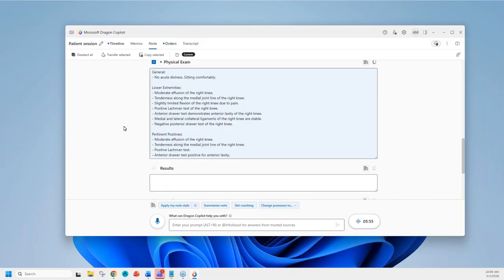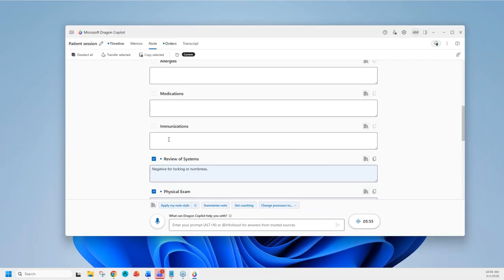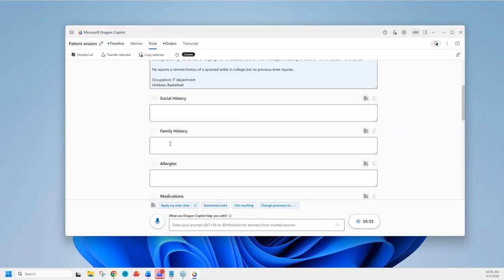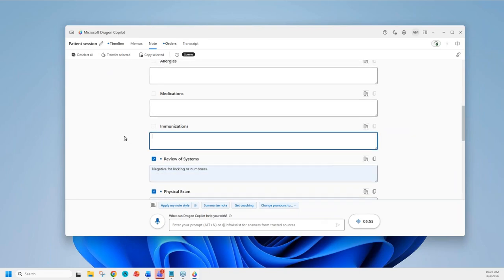Okay, so let's add some dictation. So let's see, I didn't do any procedures on you, Mark, so I think you're safe there. How's your vaccine schedule these days? You fully up to date? I am. Let's go ahead and document that. Patient's vaccination schedule is fully up to date, period. Scratch that. Patient's vaccination schedule is fully up to date, period.